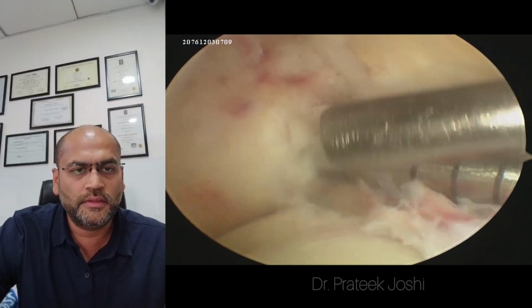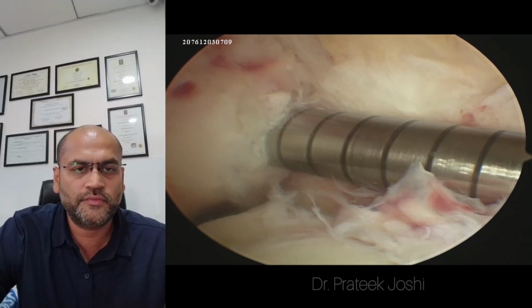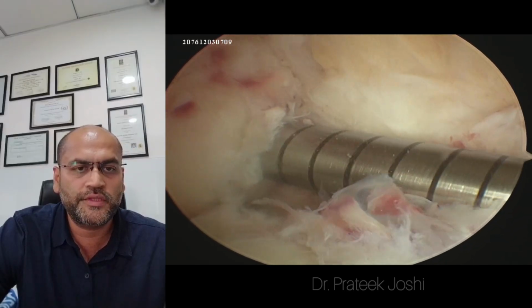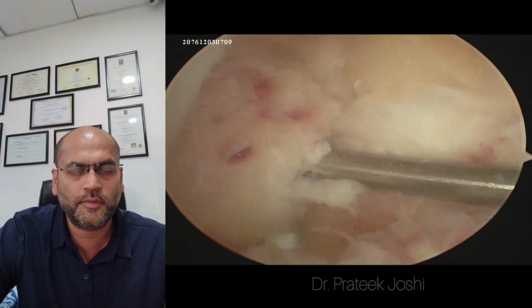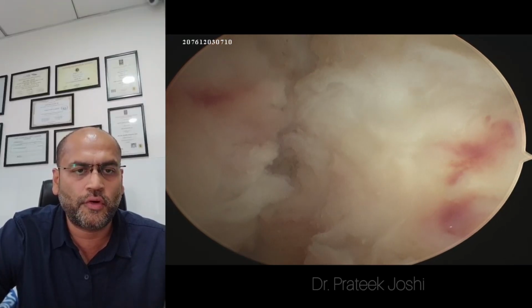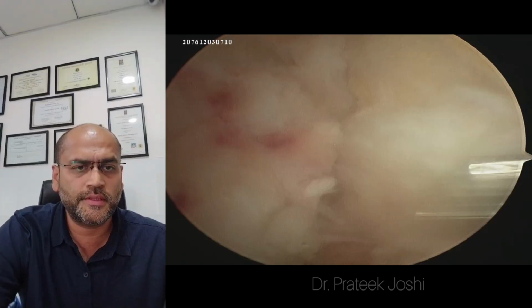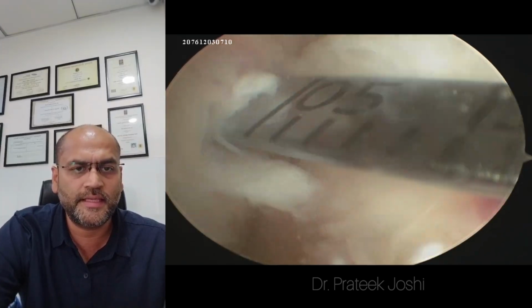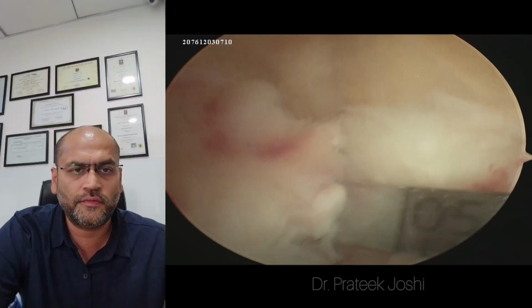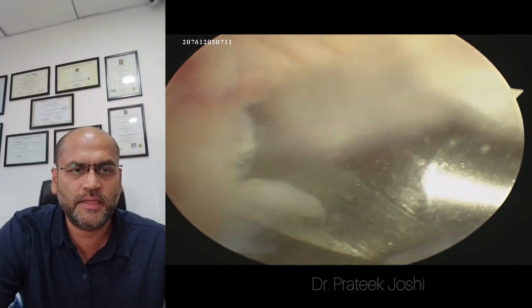On the endobutton drill bit, there are laser marks by which we should be able to have a provisional idea about the length of the femoral tunnel. In this case, it's somewhere between 40 to 45. Now I'm going to use a depth gauge to know exactly what the length of our femoral tunnel is. In this case, it is 43 millimeter.